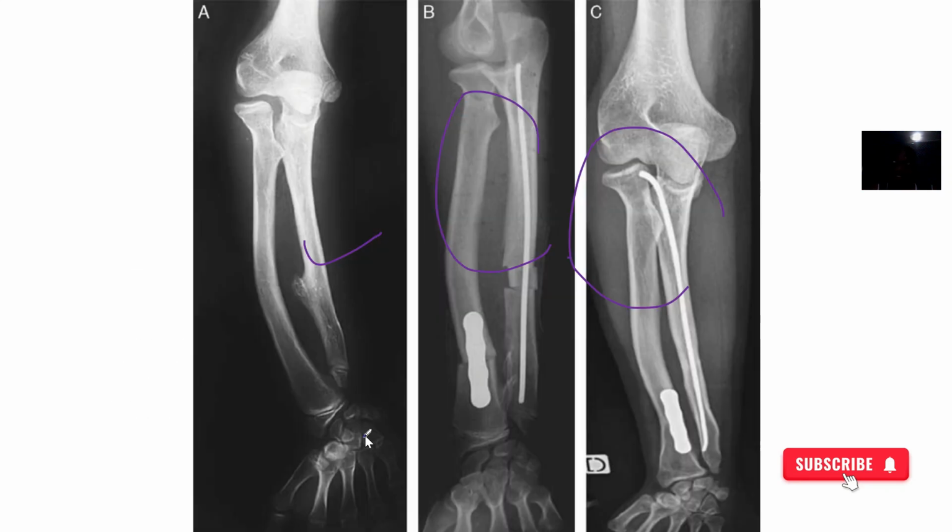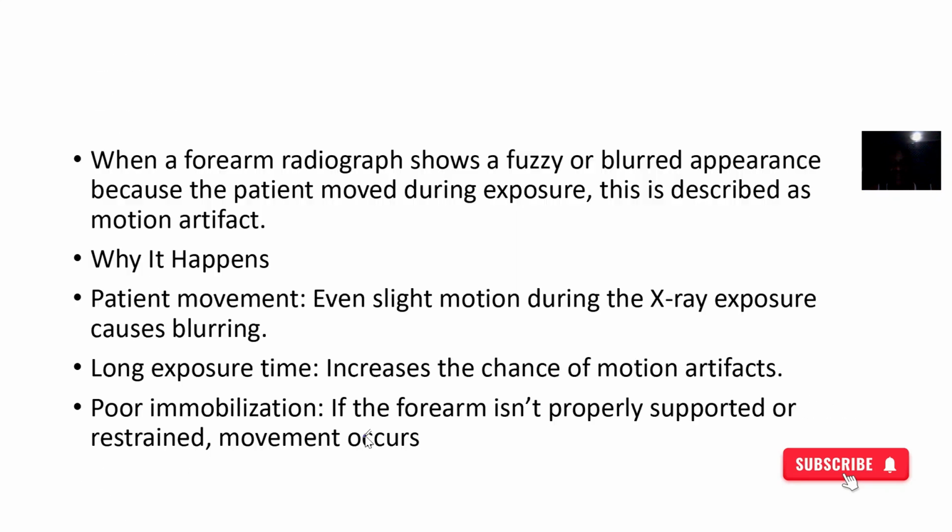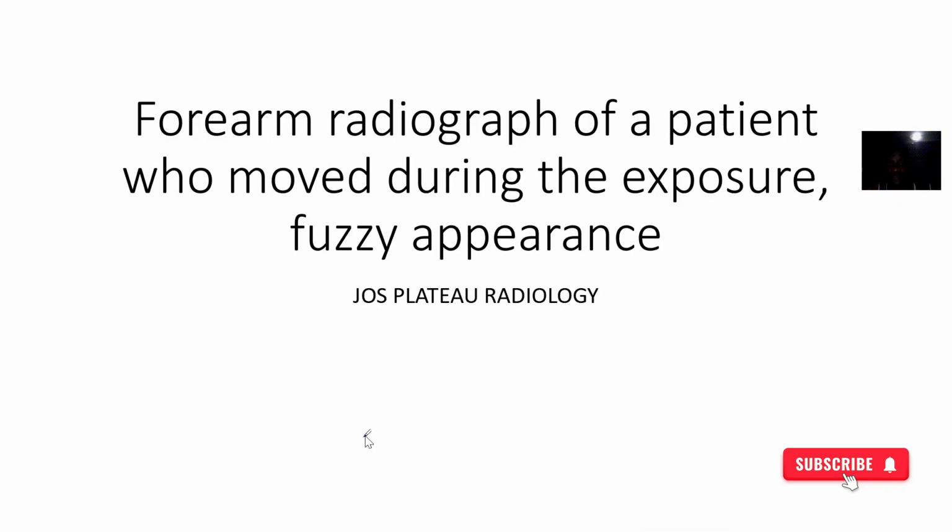If it's children, or patients that are restless or psychiatric, then you have to bring everything in so that you can hold them in a particular place and all. Okay, so this is what we got for fuzzy appearance images.